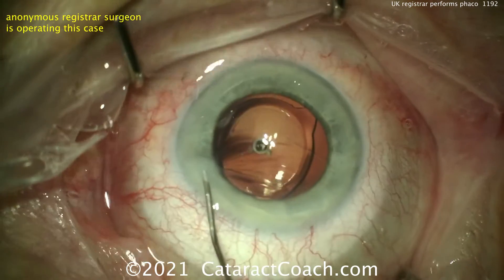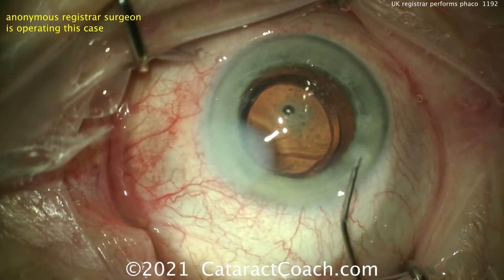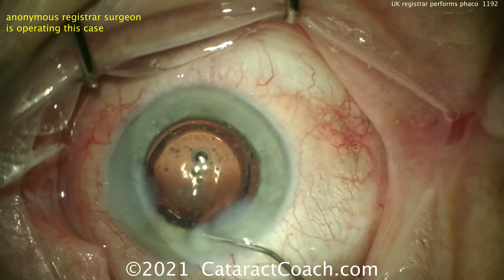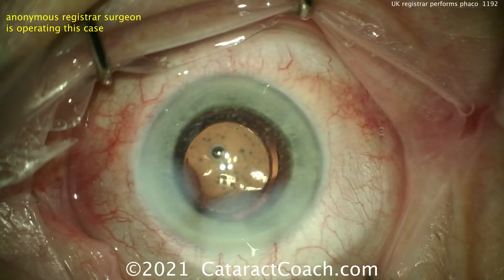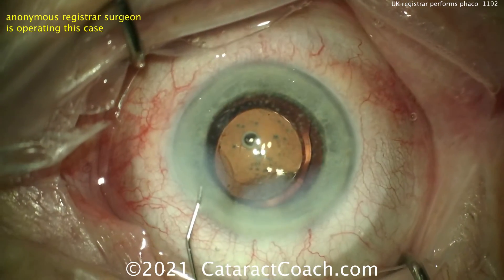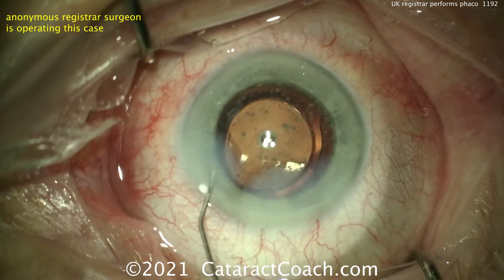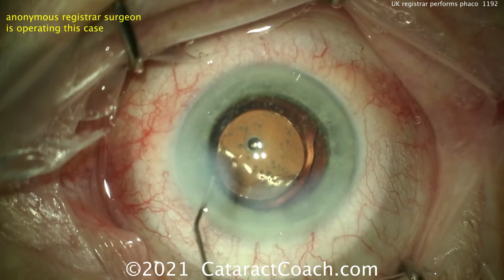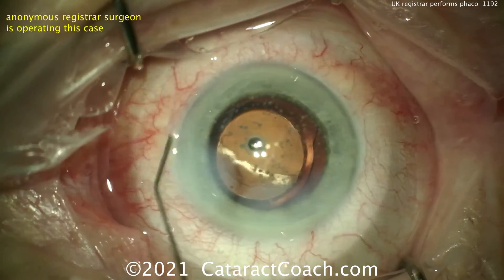Now let's hydrate and seal up these incisions. I encourage you — a little less hydration than that; that's a little generous. See my video about hydration. I think you'd be better off doing more of the roof hydration instead of aiming towards the walls. These huge white hydrated areas in the cornea are going to induce some temporary astigmatism, and the patient may not have the best vision on post-op day one because of that. So I'd encourage you to use a different technique — see how close to the visual axis that hydration is. The air bubbles I don't mind; that could be your scrub tech giving you a syringe with air bubbles, and those will absorb in just a couple hours.